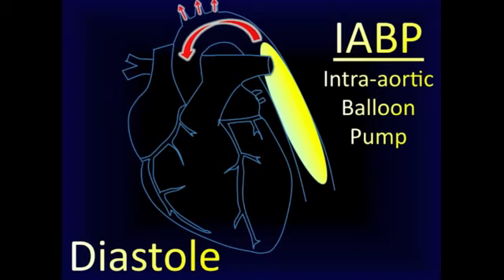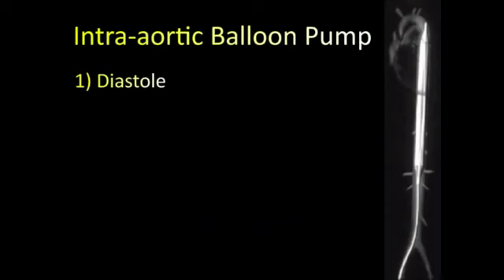And likewise, knowing the aortic pressure curve associated with these devices can have vast implications, which many of you who work in the cardiac ICU setting already know. And here we have an image of a balloon pump properly positioned in the descending aorta. This is a polyethylene balloon mounted on a catheter, and hopefully you can see the tip, which comes close to the subclavian artery, within about 2 centimeters of the left subclavian artery.